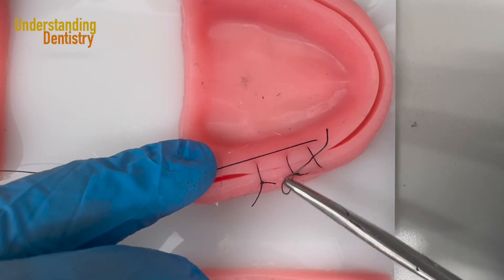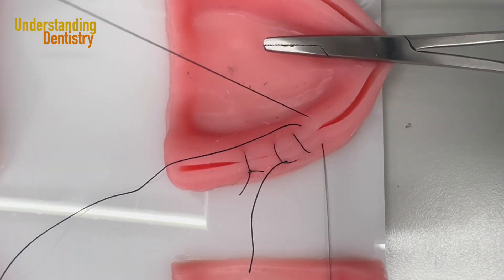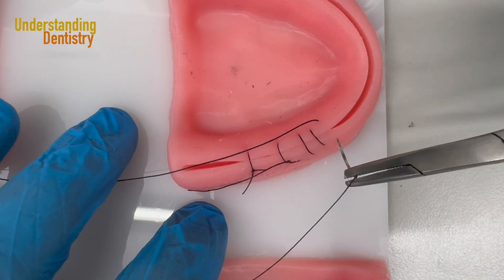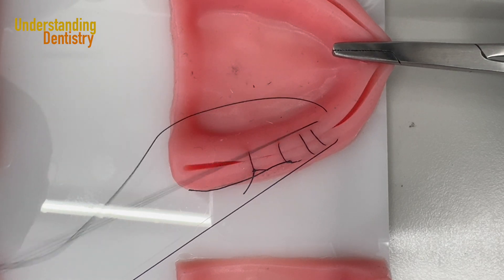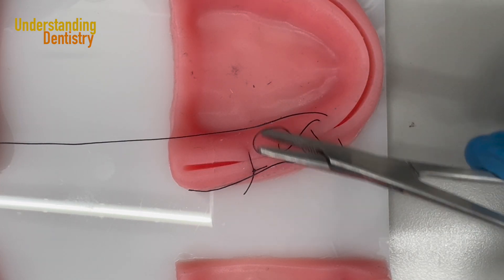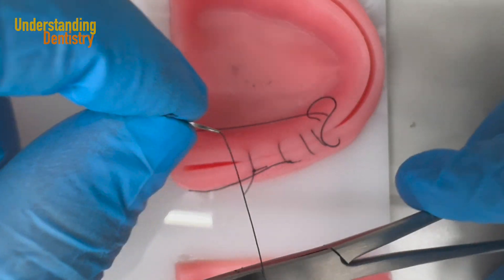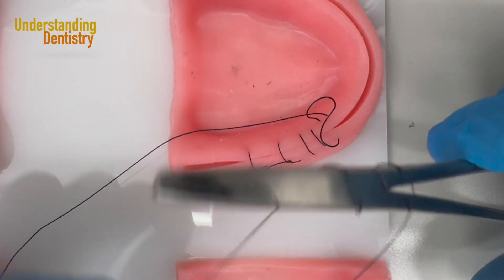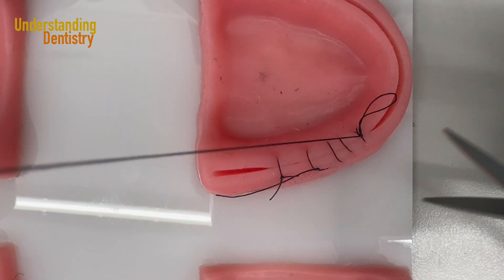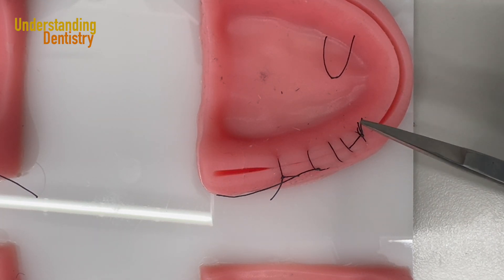If your tip is like this, release the tip of the thread because it doesn't belong here. Now I will finish the procedure — I will not pull everything through. You will realize that I have a loop here. I finish the knot with this loop since I don't have a free extremity of thread. The procedure: one, two — I grab the loop and finish the knot. I will now have three tips, because I cut the loop and the other one — the one of the needle. That's why I have one, two, and three tips.